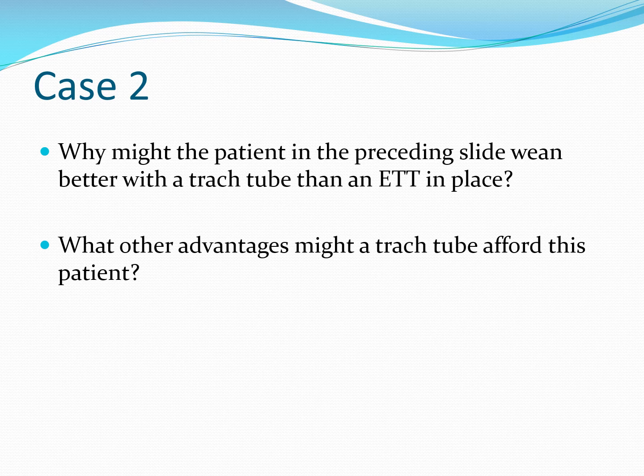Things like eating, and very important things like, as they get weaned off or are on the verge of that, potentially speech being facilitated, particularly if we got to the point where they're only on the ventilator at night, perhaps during the day they can get a speaking valve in place. So there's really a whole lot of advantages. Mouth care can be much better facilitated with a trach tube versus an endotracheal tube. Many, many advantages to a trach versus an endotracheal tube.